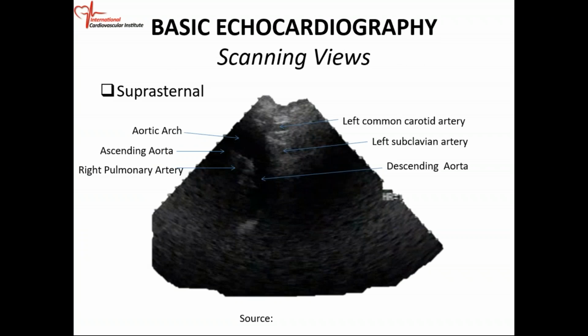So once you master these views, I mean, 90% of your scanning is complete. So I recommend that you go over these multiple times before you start scanning, because when you put that transducer on the patient's chest, if you don't memorize, everything is just going to go like that.